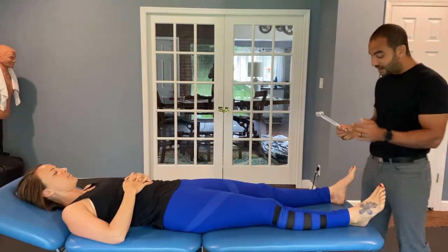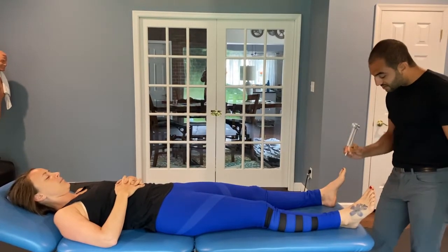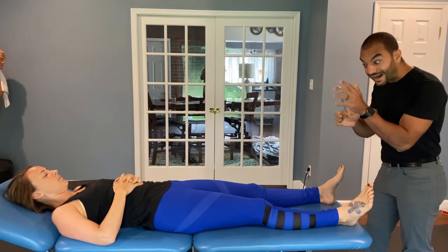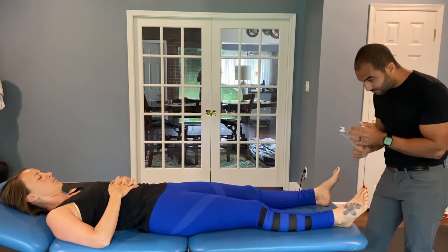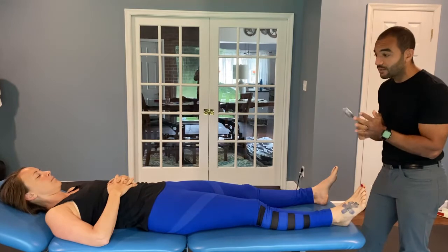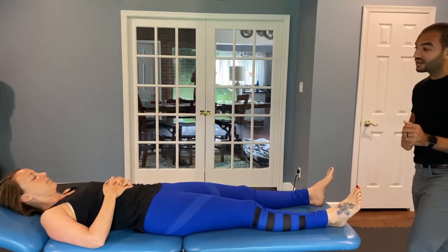Now tell me, is this vibrating or is this not vibrating? Vibrating. Good. Is this vibrating or is this not vibrating? Vibrating. Good. Is this vibrating or is this not vibrating? No. Is this vibrating or not vibrating? No. Is this vibrating or not vibrating? Vibrating. Good. Is this vibrating or is this not vibrating? Vibrating. Good. Same thing on the other side now.